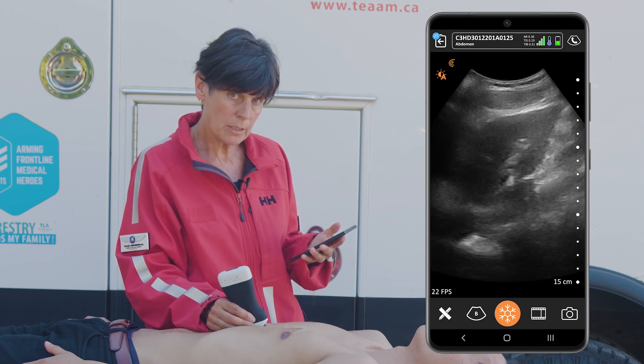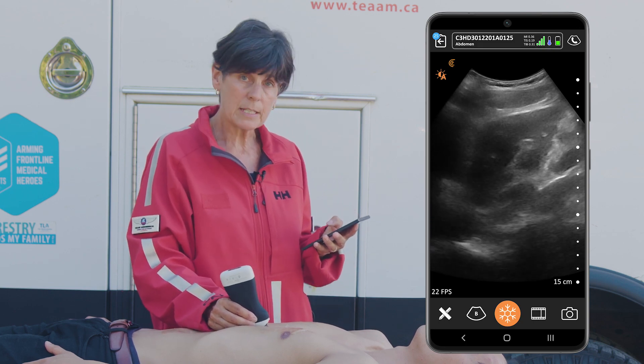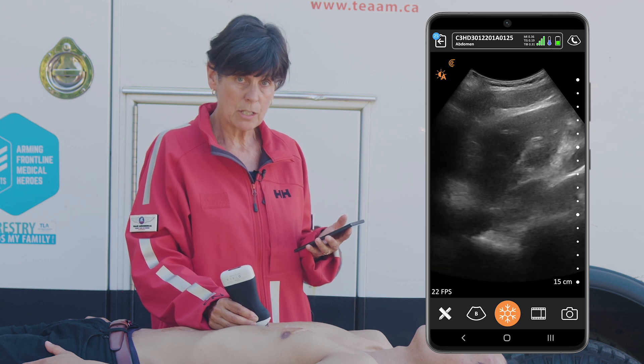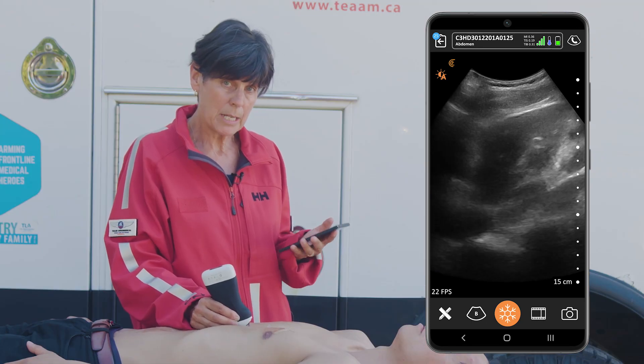The other thing we want to look for is respiratory variation. When the patient's breathing, we should see the IVC collapse. If it doesn't collapse, that's an indication of increased right-sided heart pressure, and if it's flat, that means the patient needs fluids.